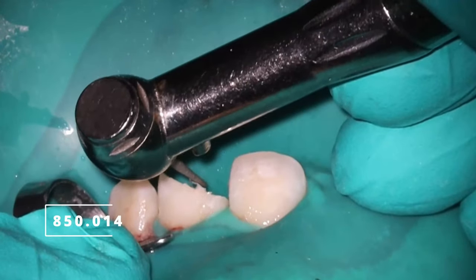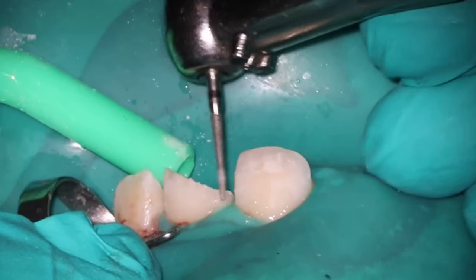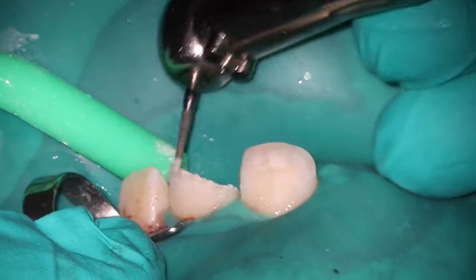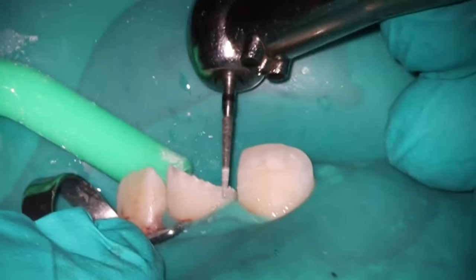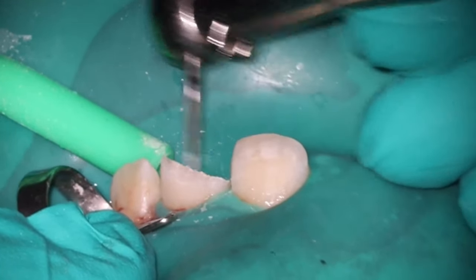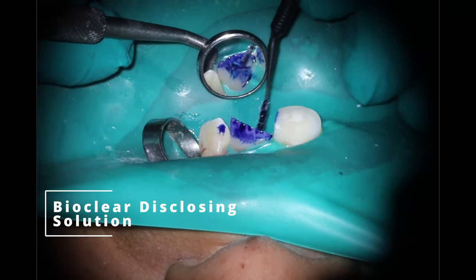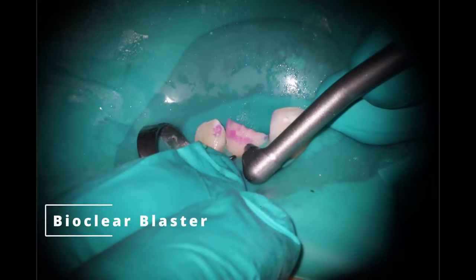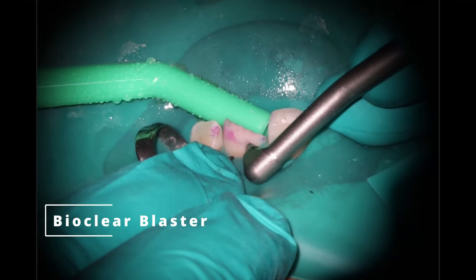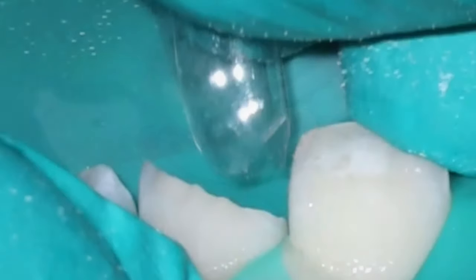And then what you want to do is go back in with a diamond and remove any part that could be on the exposed enamel, because we are relying very heavily on enamel bonding for this, because he's got such a great area there. The bevels have also helped. I did bevel the lingual off camera there. I kind of cut it out there. But we're going to go through the normal process like we do for any filling, disclose, blast off the nastiness there.